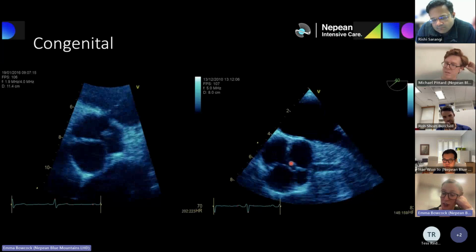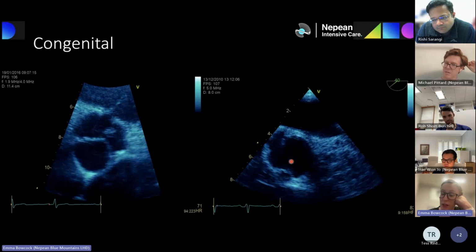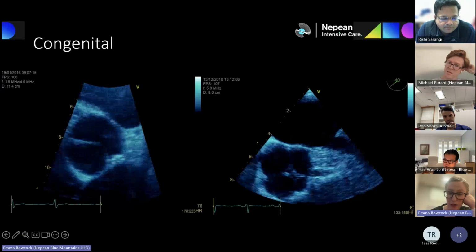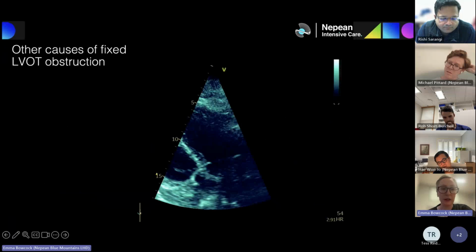But this valve hasn't got stenosis, it's wide open, isn't it? But they can develop things like that. So they're at risk of getting degeneration and things like that as well. This patient will almost certainly have some aortic regurgitation.